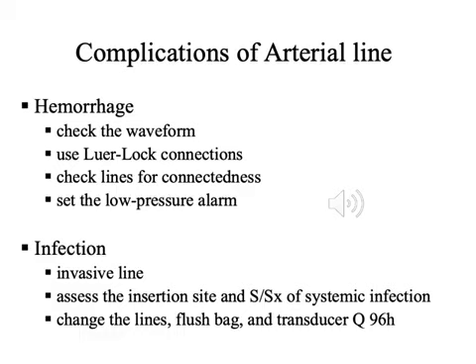Any signs of infection should be monitored and observed. And as we said, sterile dressing with changes should be applied for these patients to prevent any complications that could happen.